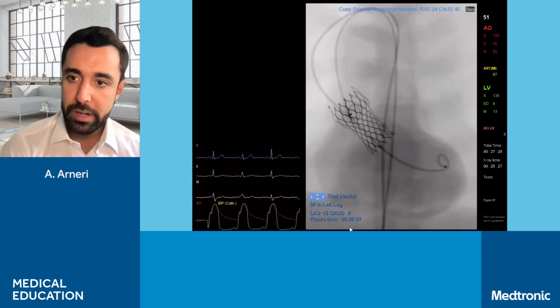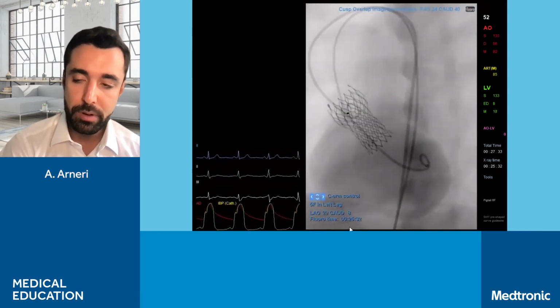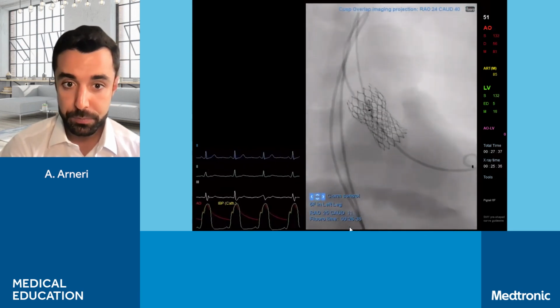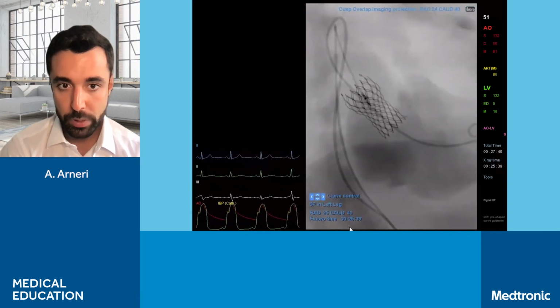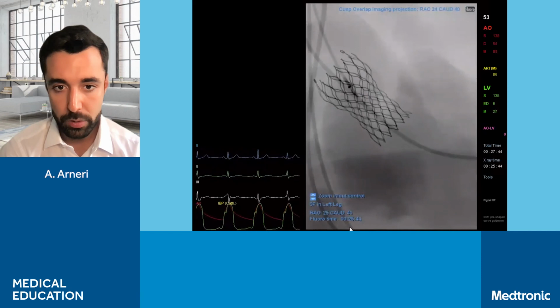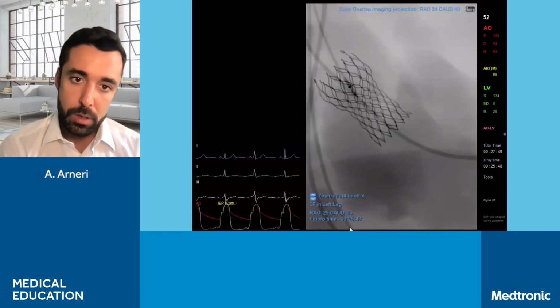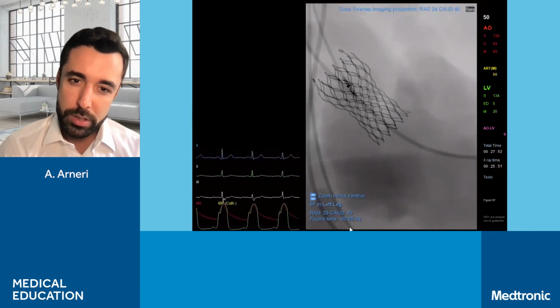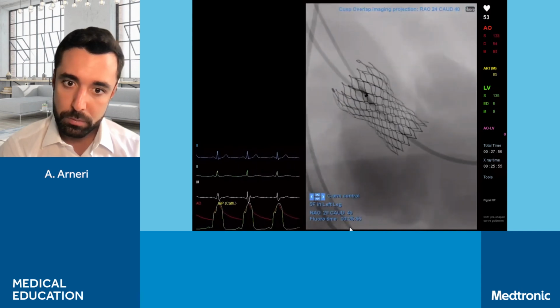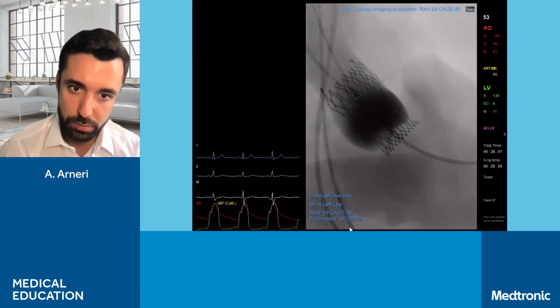We can go now in cusp overlap view and do a final contrast injection there because we want to really assess the implant depth of our valve in the cusp overlap view, which is telling you the true implant depth. We can maybe also zoom a bit now. Okay, can we remove some RAO? We want really nice parallax now. Okay, perfect. And now we do a contrast injection.